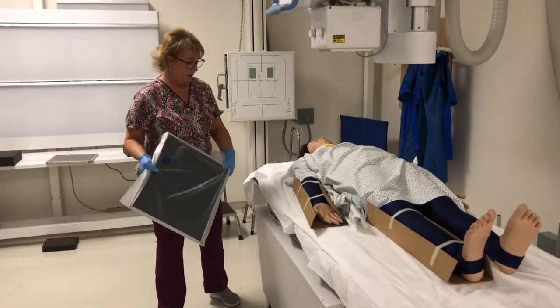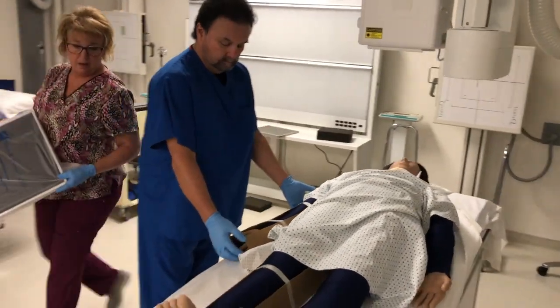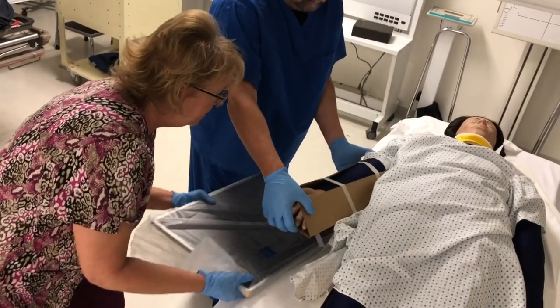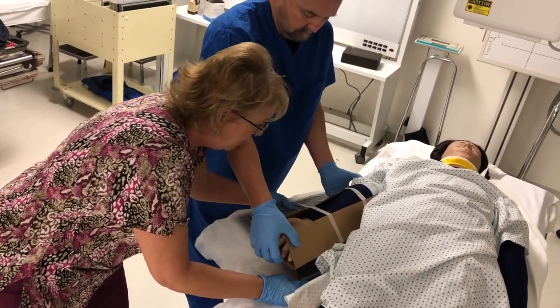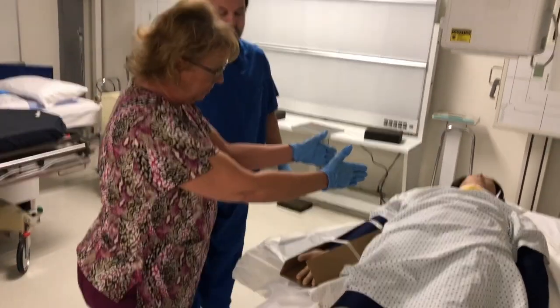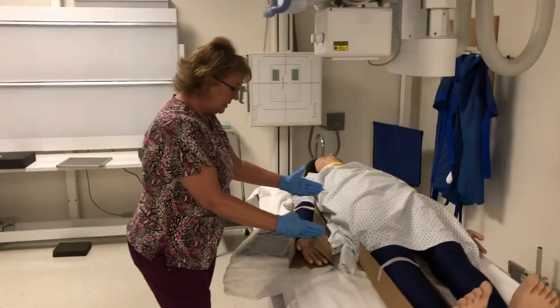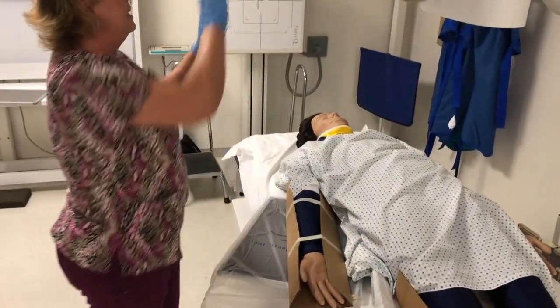So I would have my coworker come in, support the arm proximally and distally, and you lift it only as much as is required to get the cassette under them. At this point, it really doesn't matter if you have perfect alignment because we're just trying to get this done. So I want to make sure that I've included the wrist and past the elbow on this. My patient's size affords that.